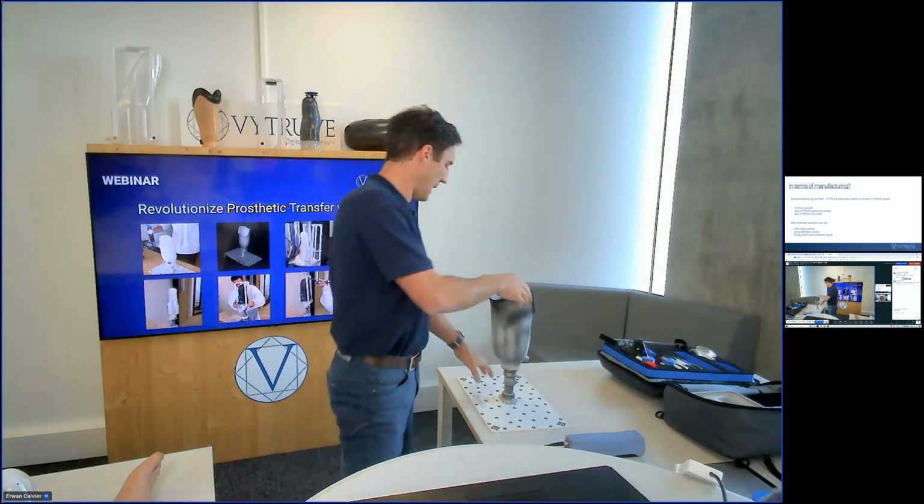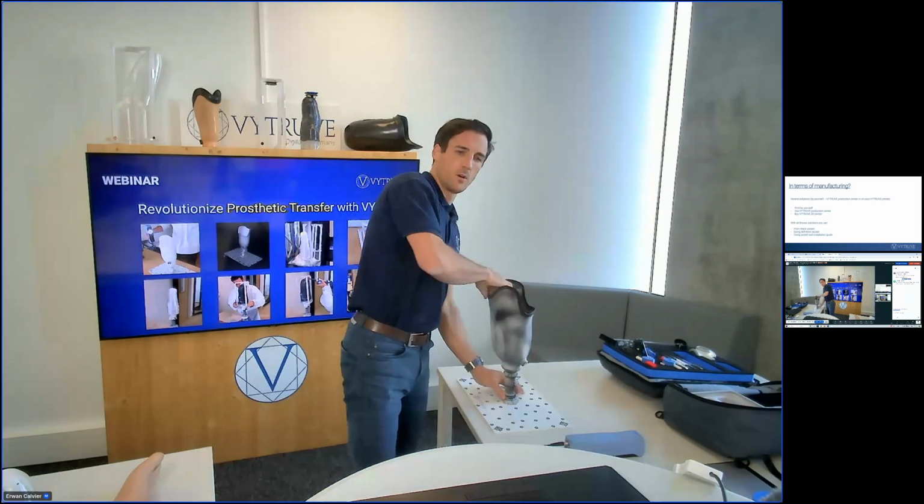Everything is okay. So the patient can keep the socket. So I can return the socket to the patient, and he can come back home, and after I will do the manufacturing.